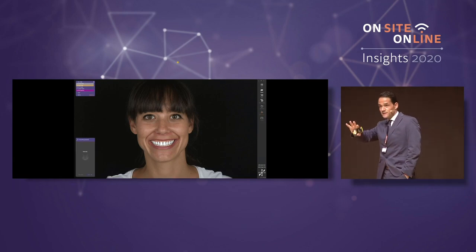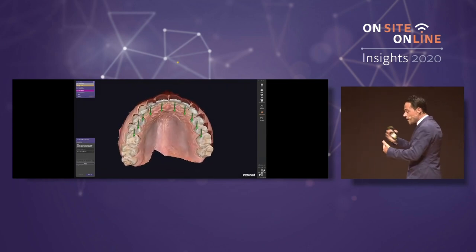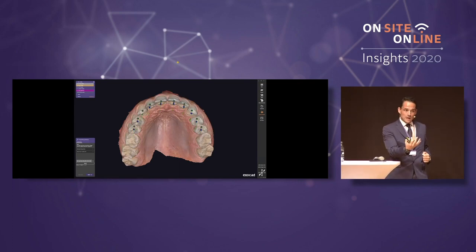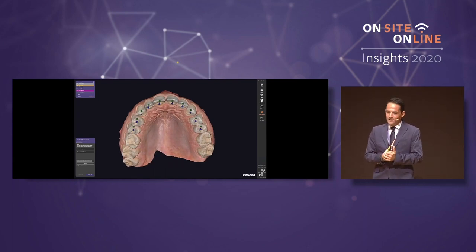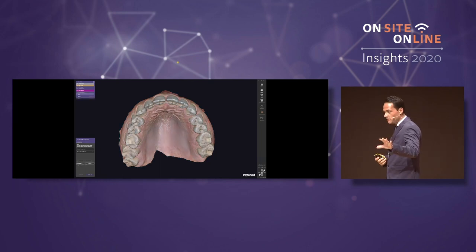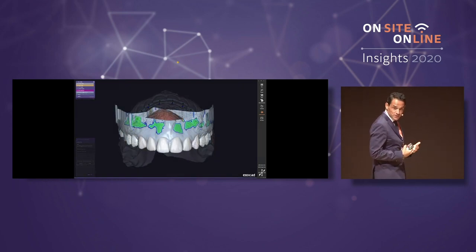Look at this. It is going to be exactly the same as what we are going to get in the mock-up we are going to do. We block out the model. I'm not going to explain it because Michel Conan has explained that in his presentation, this new feature, but the model is perfect, it's blocked, so we can adapt the mock-up without retentions.